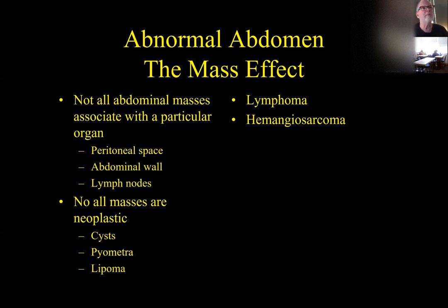So just because you have a mass effect, number one, people kind of get in the habit of thinking, oh, it's got a mass effect, it's an old dog, it's probably cancer. Well, it could be, but there's lots of other benign things that can cause a mass effect that's not cancer.